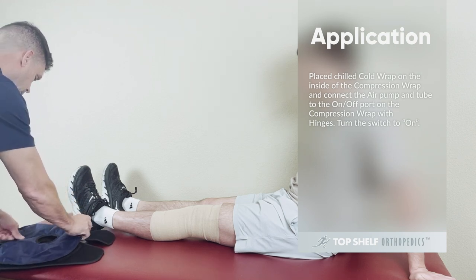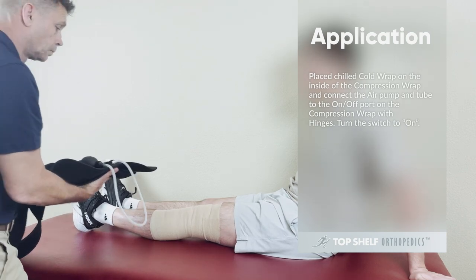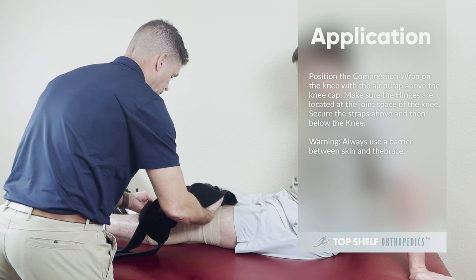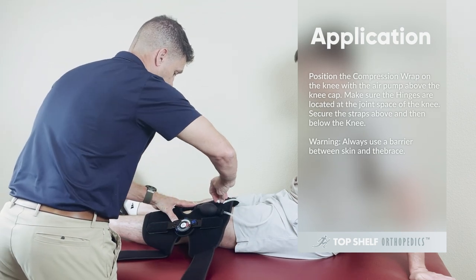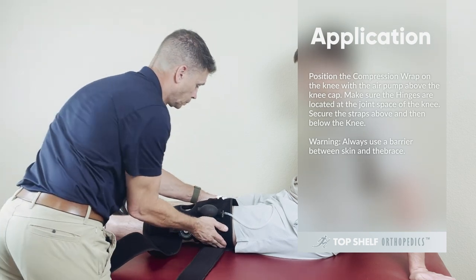Turn the switch to on. Position the compression wrap on the knee with the air pump above the kneecap. Make sure the hinges are located at the joint space of the knee. Secure the straps above and then below the knee.